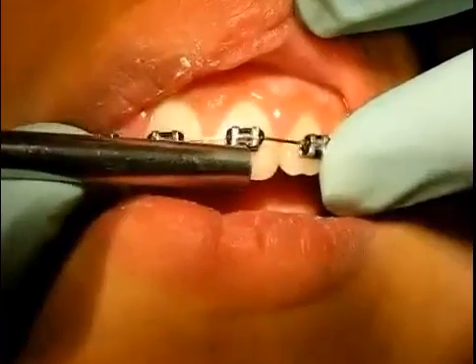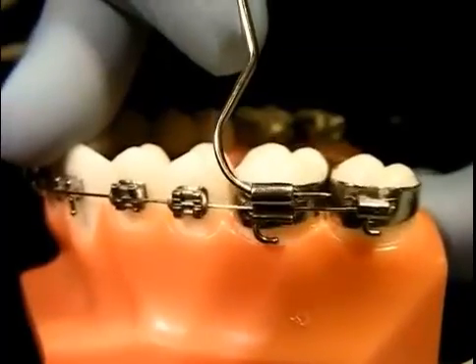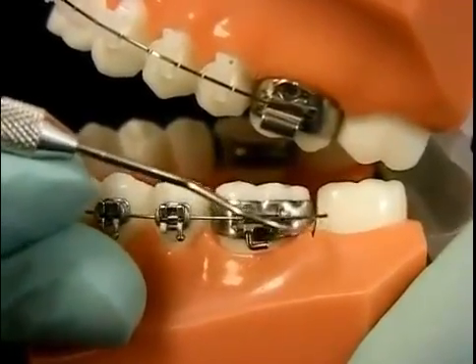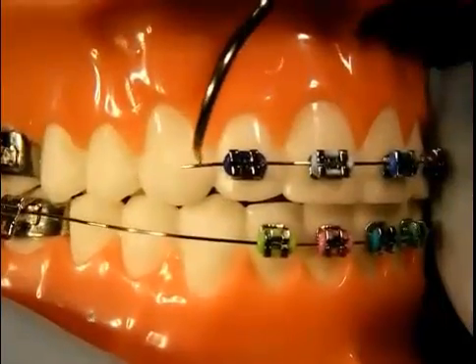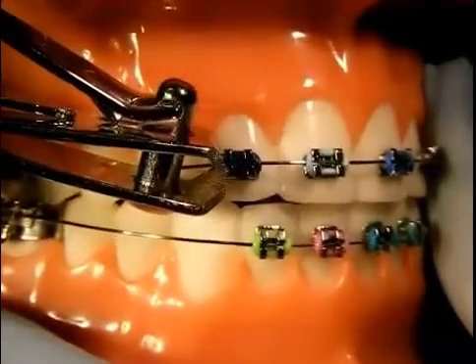Although there are very few true orthodontic emergencies, during the course of treatment you may discover that parts of your braces may become loose or broken. You may also discover that wires may shift and begin irritating your lips or cheeks. In this video, we will address some possible orthodontic situations and how they may be remedied at home.